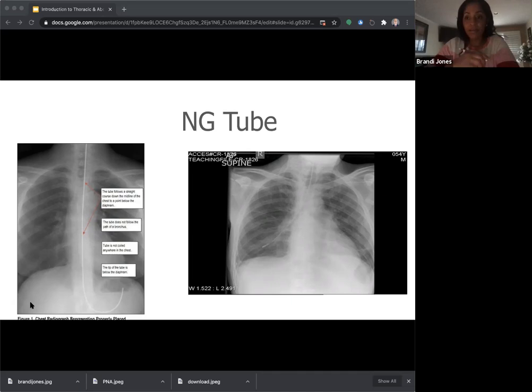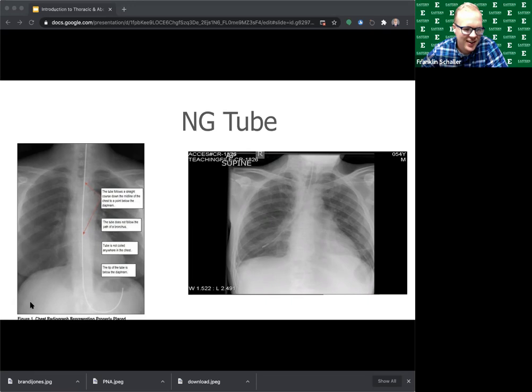You guys see that? What happened there? Went into the right bronchus. It sure did. So I wonder if it went to that right bronchus, how is that patient going to be acting clinically? Dyspneic, O2 desatting, choking, coughing. 100%. I agree 100%. So in that situation, we're going to want to intervene and gently remove that NG tube. That is not very good placement.